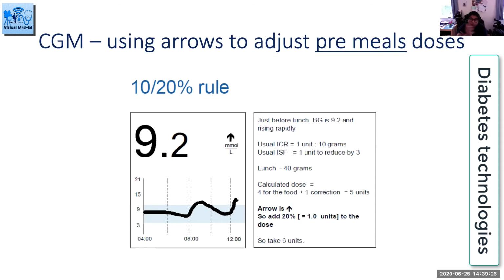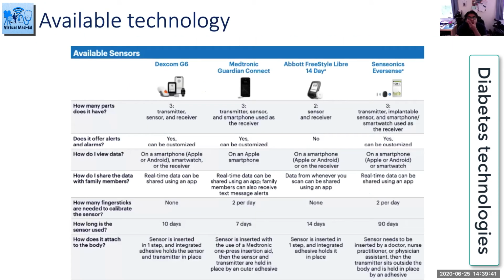And I'm not going to go through the calculation. As you can see, it's fairly straightforward. But for the predictive glucose method, there's more calculation to it, and you can easily do it from our point of view, but from a patient point of view, to keep it simple. So we're moving on to the area of the learning in terms of available technology.